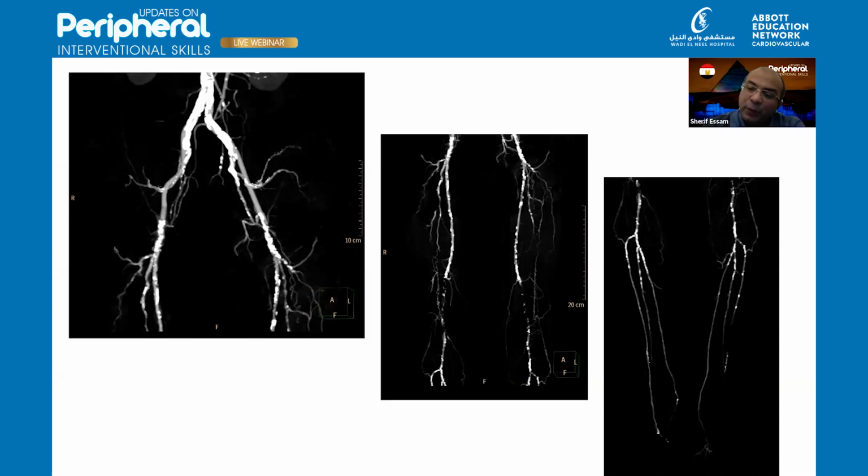And for the retrograde access, we were nominating the anterior tibial artery. Brachial right or left? Left brachial access, because he had a coronary angiogram recently with radiologists, and we were happy with his CABG, so there was no problem regarding this point. But we were planning to go brachial and retrograde. And for the retrograde, we have chosen the anterior tibial artery. Why did we choose the anterior tibial artery?